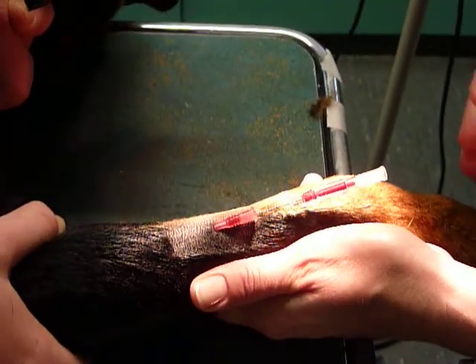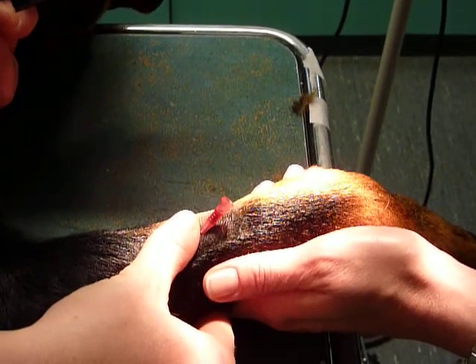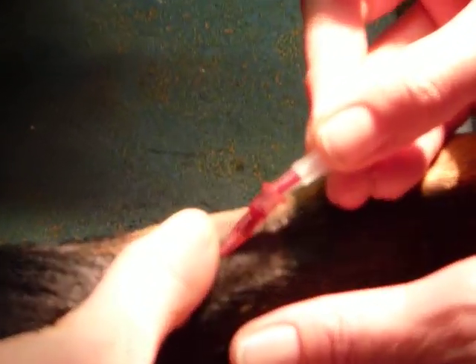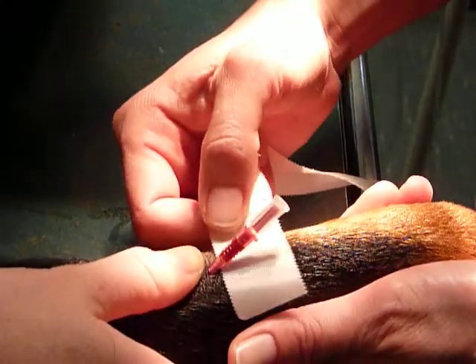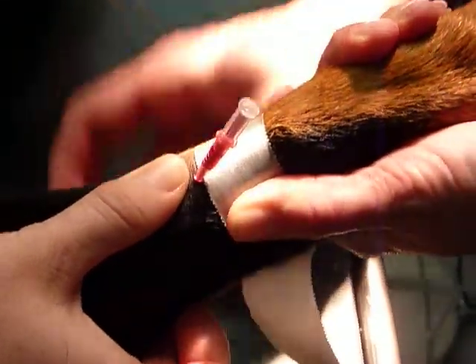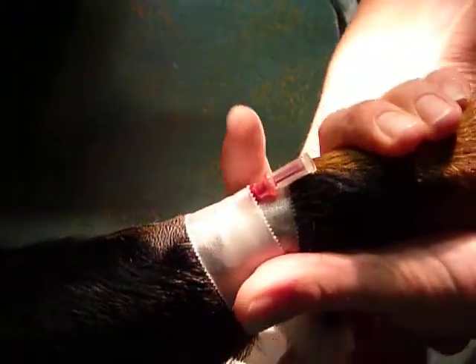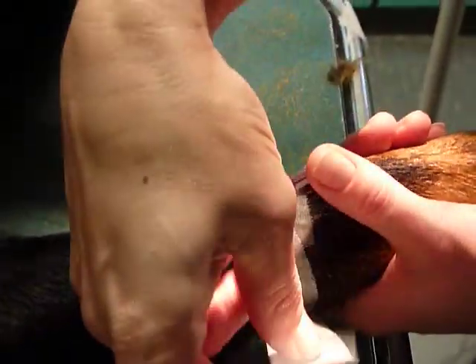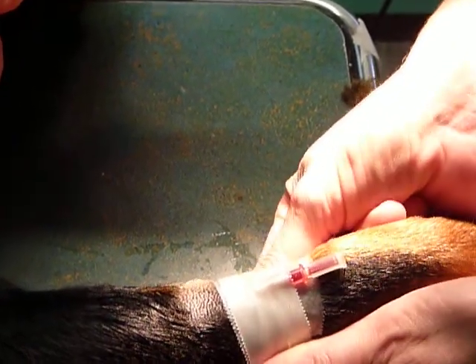Your veterinary nurse is going to hold the blood at the end of the catheter to ensure it doesn't come out all over the table. Plug into the base of the end of the catheter. Then we are going to tape. Get your veterinary nurse to keep the end of the catheter raised so you can place the tape up under the end of the catheter, around the animal's forelimb, and up and over the top. Always make sure you have good contact with the tape all around the catheter to stop any movement.